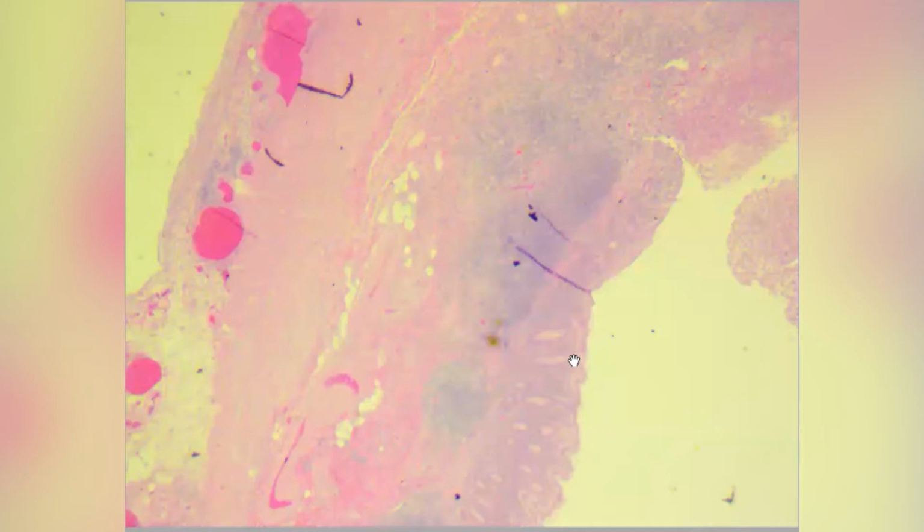I hope you can appreciate here the four layers of the appendix, which are: first, you have the mucosa, which is composed of the epithelial lining, and then the lamina propria and the muscularis mucosa, and then you have the submucosal layer, then you have the muscularis propria, and at the end, the serosa.